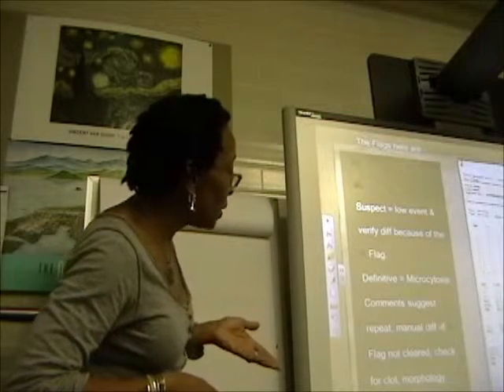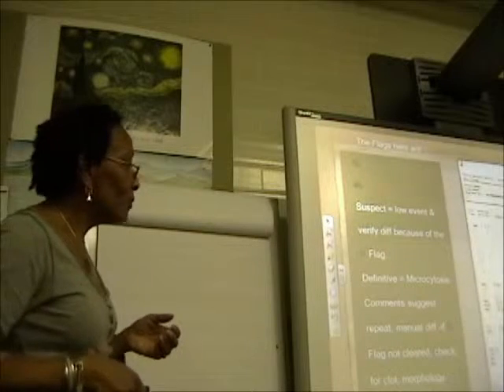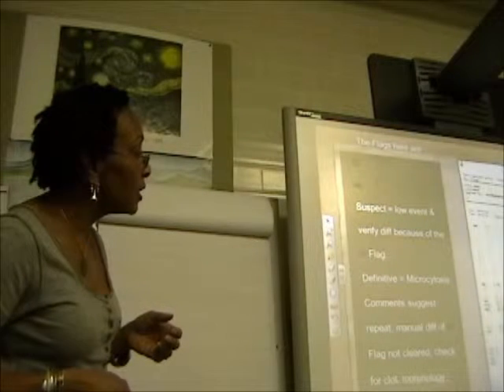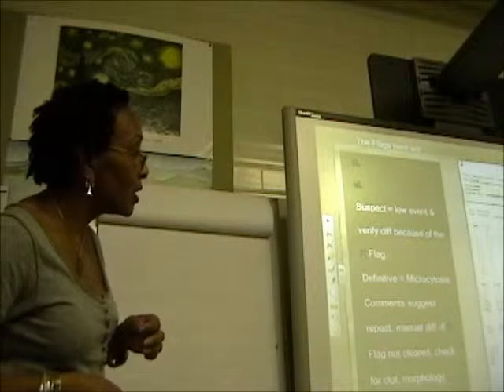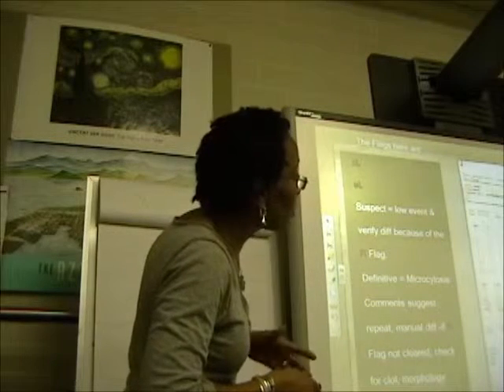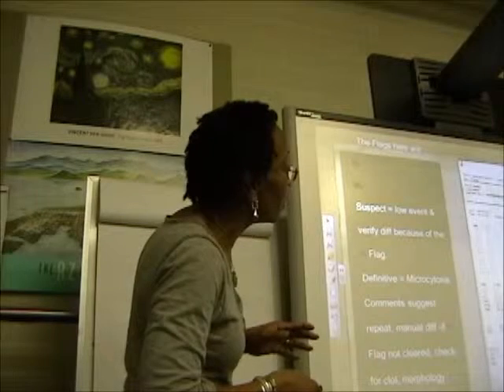So they had to check it for a clot. They had to do a manual differential, and this one got sent to the pathologist too, because it did violate some of the rules that Mercy has in place. But you can see right here that on the data plot, there's no separation of cells, and everything looks like it's just clumped down in one area.